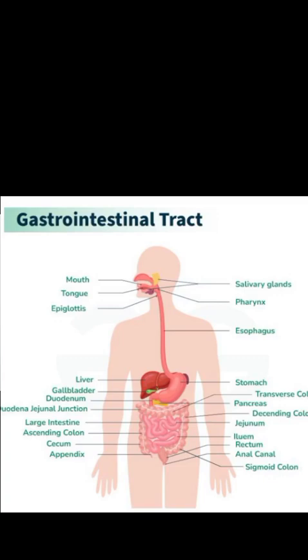Today, in this session, we are going to be talking about stool analysis. It's one of those tests that we can use in order to identify several infections that are deteriorating the standards of our lives. Stool analysis is a series of tests that we do in order to diagnose GI-related conditions.